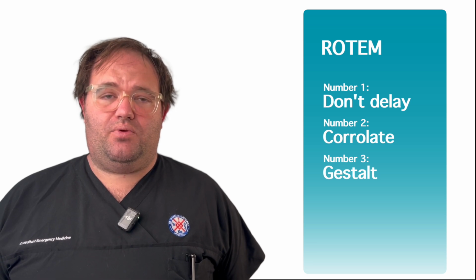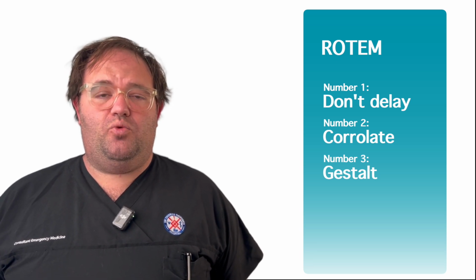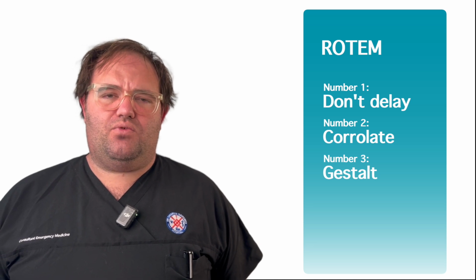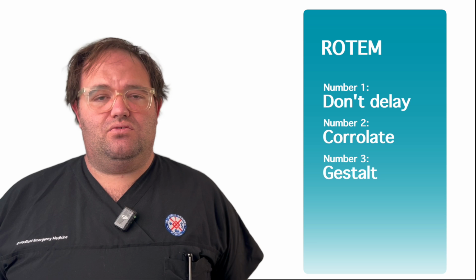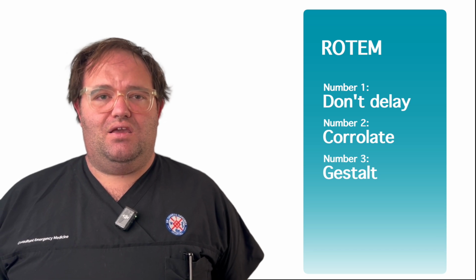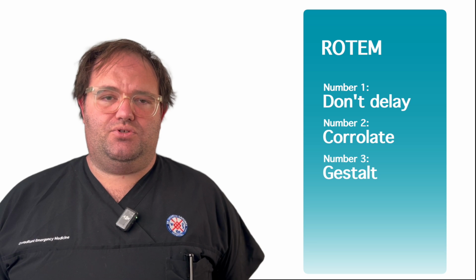Remember, don't wait for all parameters. Start interpreting as soon as the A5 is available. Secondly, the clinical picture is very important. Does the ROTEM fit with what you're seeing in front of you? Third, these are guidelines, not rules. And lastly, if in doubt, consult your local haematologist for any guidance about ROTEM interpretation.